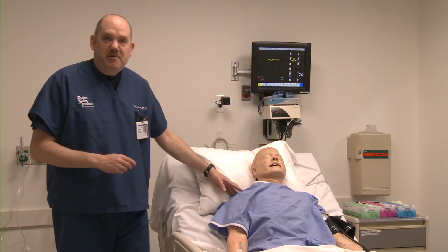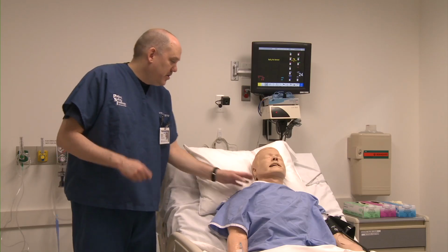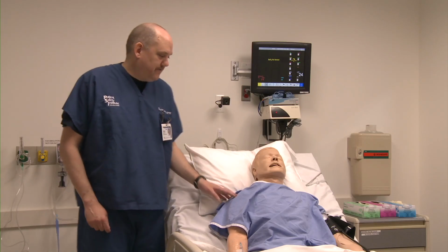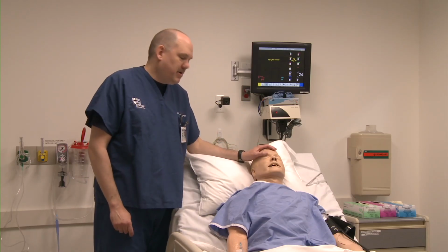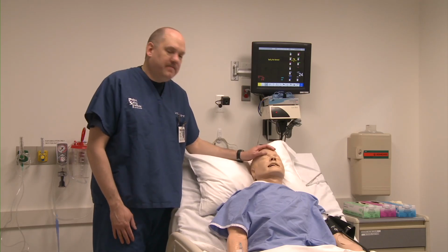In addition to speech, all of our simulators can make pre-recorded vocal sounds such as coughing and sneezing. Could you cough for me, Mr. Moore? Thanks, that was wonderful. Although our simulators cannot open their eyes, each simulator does have a set of eyeballs and pupils, so it is important to assess them and tell us what you find while you do your assessment.